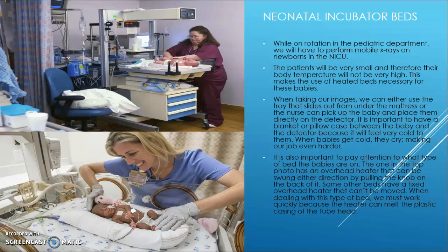It's also important to pay attention to what type of bed the babies are on. The one in the top photo has an overhead heater that can be swung either direction by pulling the knob on the back of it. Some other beds have a fixed overhead heater that can't be moved. When dealing with this type of bed, we must work quickly because the heater can actually melt the casing of the tube head when you put it under, which has happened.